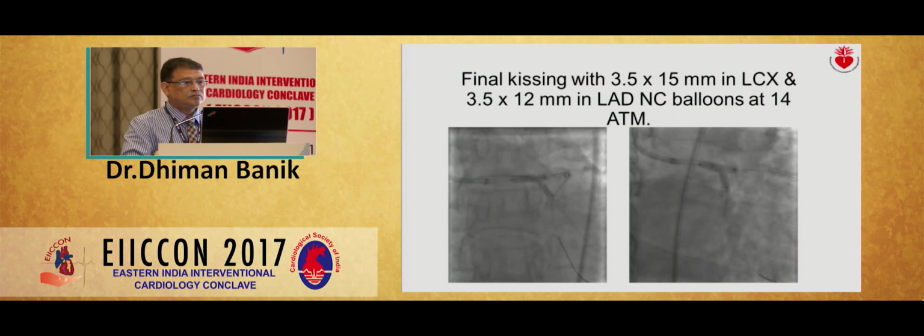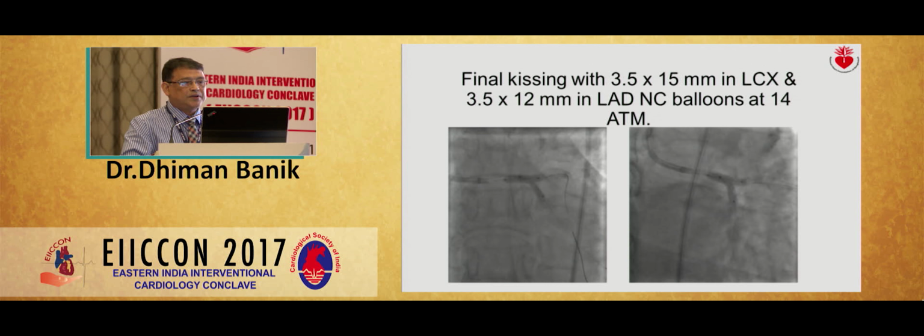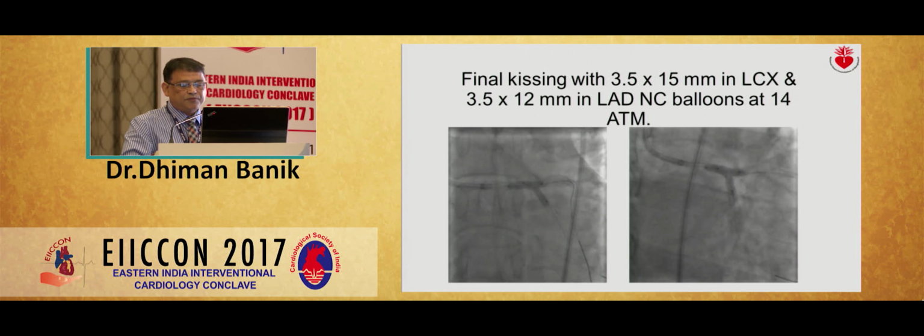Final kissing with the 3.5 by 15 millimeter NC balloon in the LCX and 3.5 by 12 millimeter NC balloon in the LAD at 14 atmosphere.